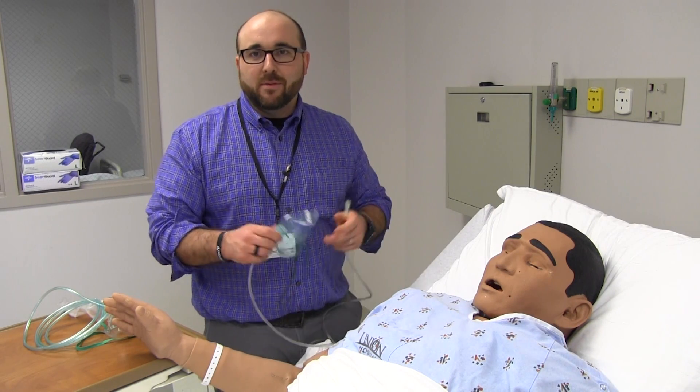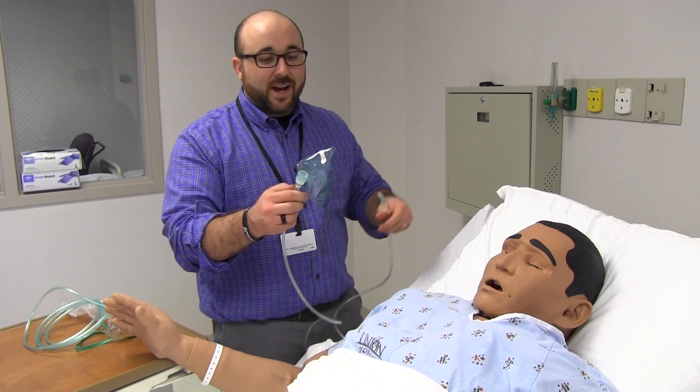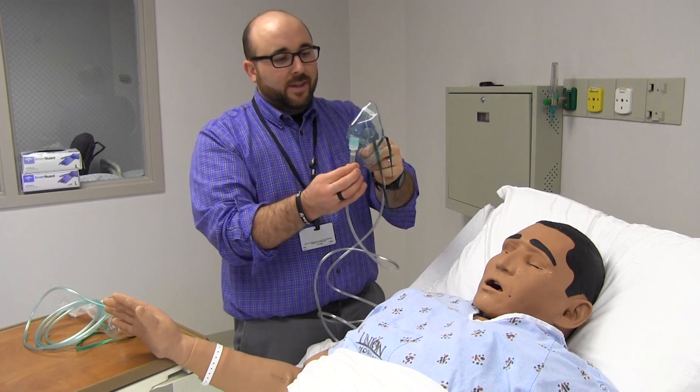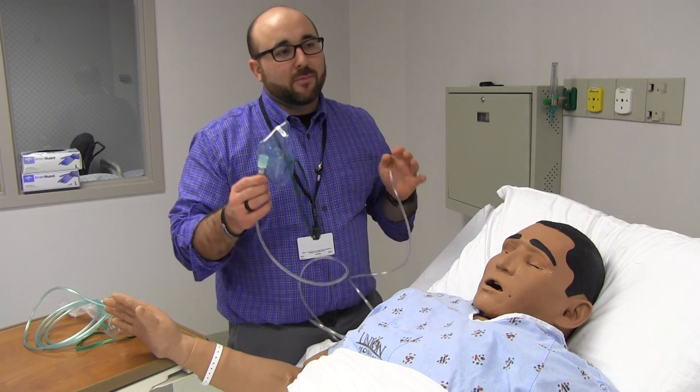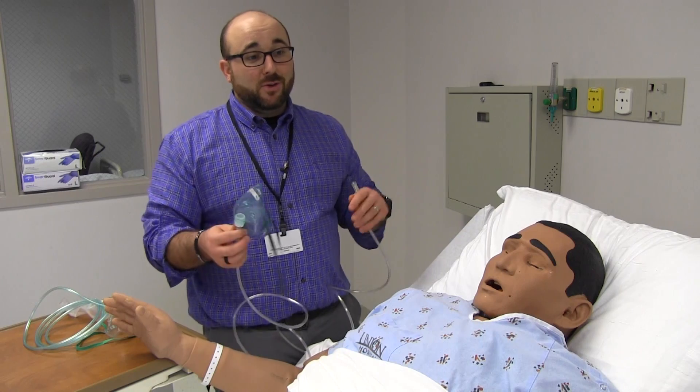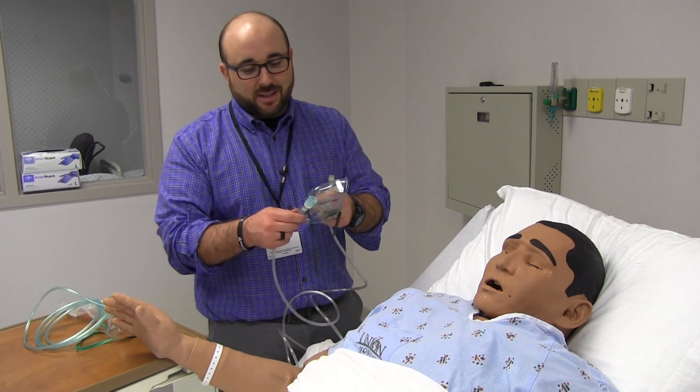Maybe their saturation will come up, maybe they'll feel a little better. But with this device — it's a mask with a little adapter on it — it's going to deliver anywhere from about 40% to 60%. That's a broad range, so it's nothing we're going to use when we're weaning oxygen or anything like that.